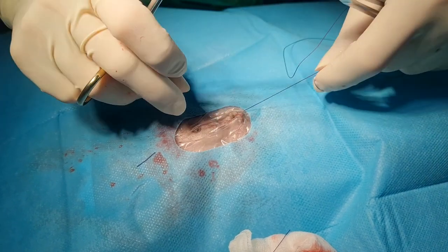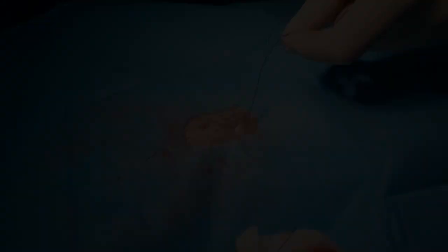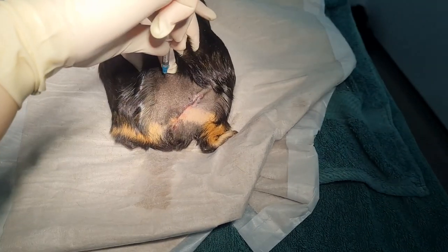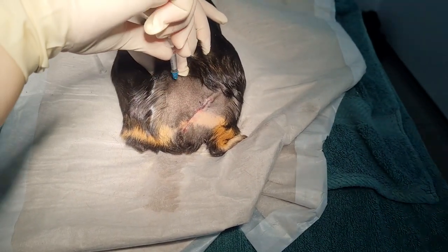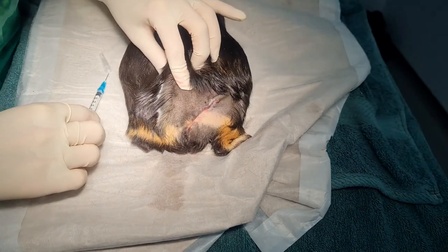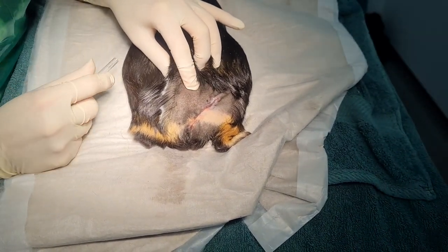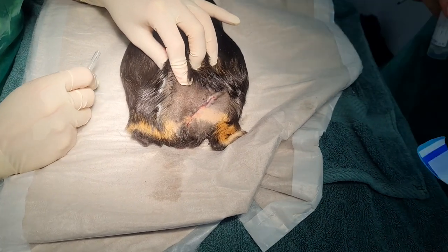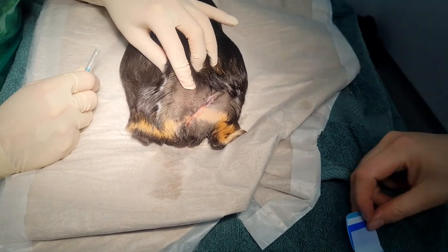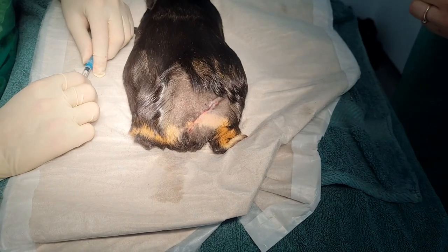Almost time to wake her up. She's having intramuscular atipamezole. She has got another wound there — that was just a standard mass removal. Then we'll be keeping her on the oxygen and keeping an eye on her temperature until she's woken up.